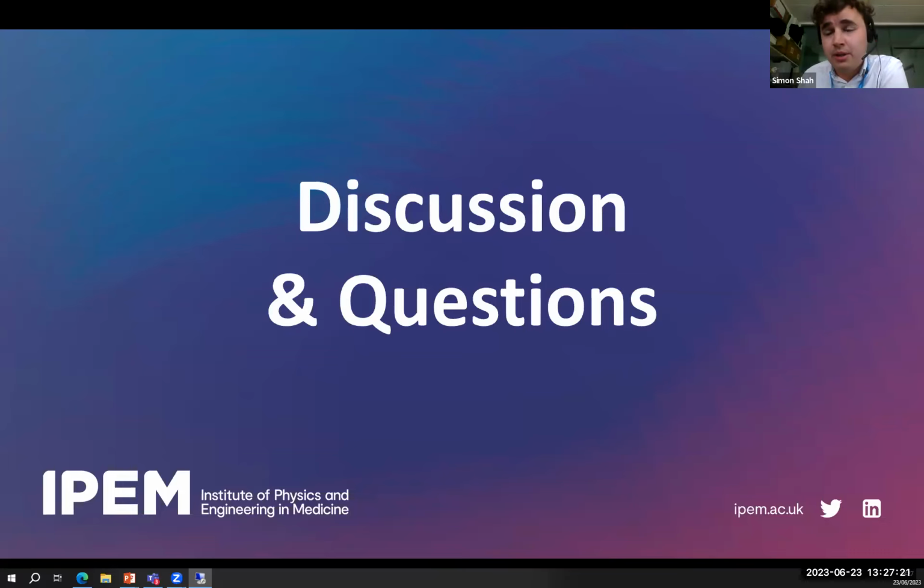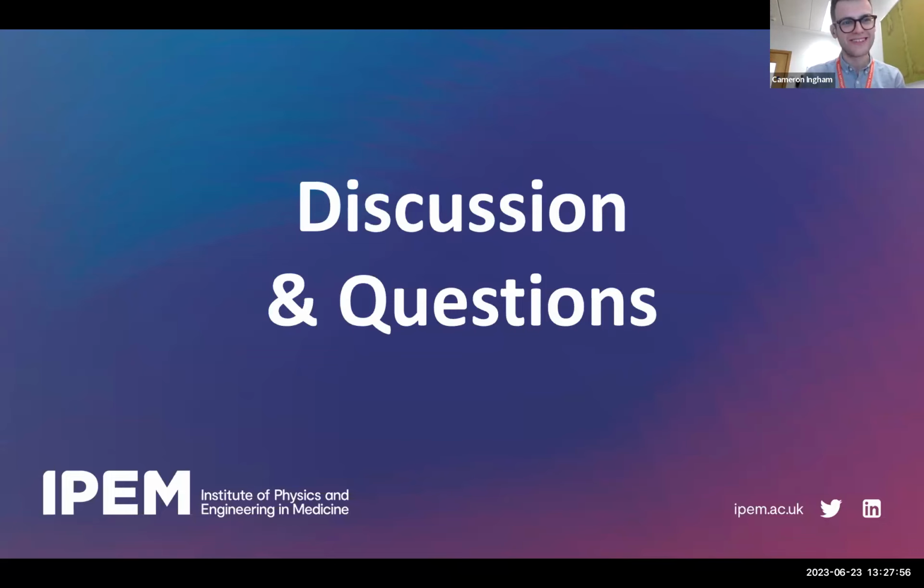A really interesting point is you're obviously going to be starting from different points, in the way a site optimizes a protocol. In that slide that I showed for the Deep Resolve of the knee, it was the work done in the Northwest region. Our knee protocol here at Guy's and St Thomas's starts off at 10 minutes. So if we optimized it and shortened it, we're not going to be saving the 74% of time because our sequences are only 10 minutes. So it's going to be where your starting point is as well, which is really important to remember. Absolutely. And bearing in mind patient preparation time and not just halving imaging slots.